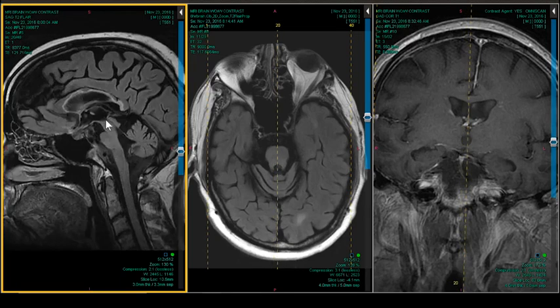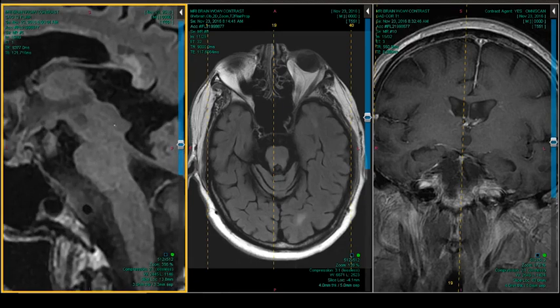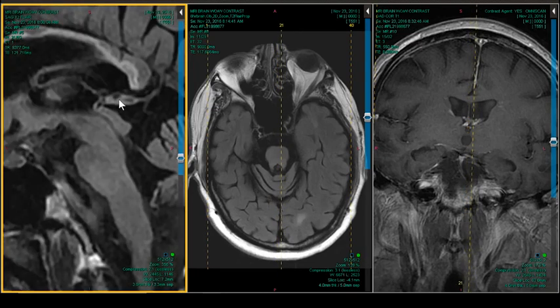And this time we don't have atrophy of the superior colliculus. It may be flattened out a little bit, or if we do, it's very mild, not nearly to the degree that we saw previously. There's the posterior commissure and habenular area here. Can't separate them out that well. Pineal gland. I'll demagnify for a minute.